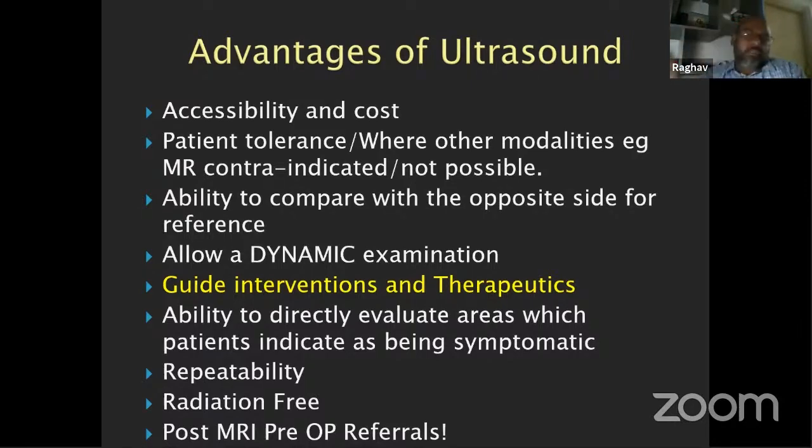We can actually see, as Dr. Daftari said, how a tendon, a ligament, or a structure behaves, and how much is the susceptibility of that structure. We can do a dynamic examination by moving a structure, and by moving the transducer. Also, very importantly, there is no contraindication for ultrasound, and you can do it in absolutely every condition: a pregnant lady, in the emergency, with implants, without, just simply everything.